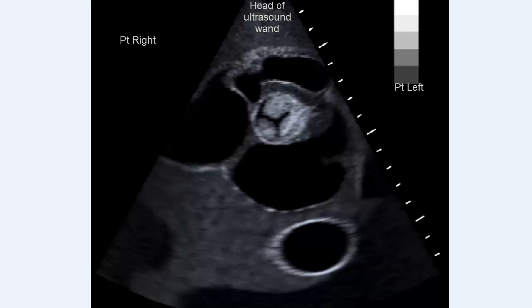So, this is an ultrasound image of a closed aortic valve. You can see the one, two, three valve leaflets about to form a tight junction here. This is what it should look like normally when it's almost closed, so that it can prevent backflow from the aorta into the left ventricle.